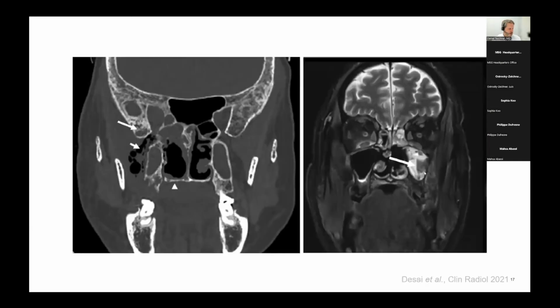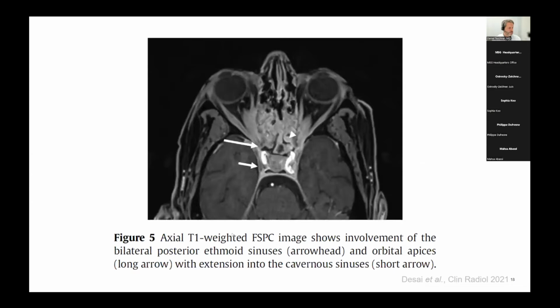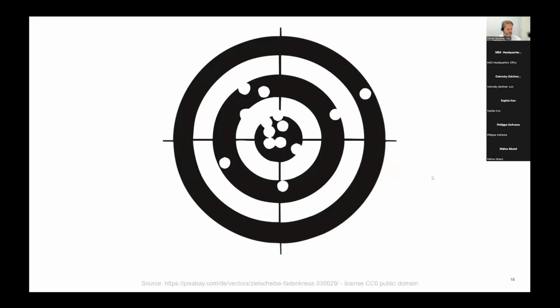Of course, we use MRI and CT techniques. We want to see whether there is a bone affection, or if we want to examine the soft tissue in detail. And you can additionally use specially T2-weighted techniques to distinguish between the soft tissue, more fungal-like lesions or not. But nevertheless, you're trying to be more specific, but of course this is not specific.